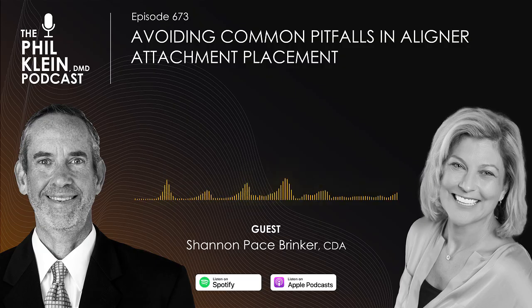And now you still have the template on the arch. What's the next step when you're ready to pull it off? It's a little hard to get off. Now it's got these really nice attachments, so it's full and it's going to be hard, because again, the whole thing was we want that to be engaged. So we're going to have to pry it off a little bit. And this is so critical, when we talked about only etching the areas where the attachment is going to be placed, because the adhesive is going to go straight to that.